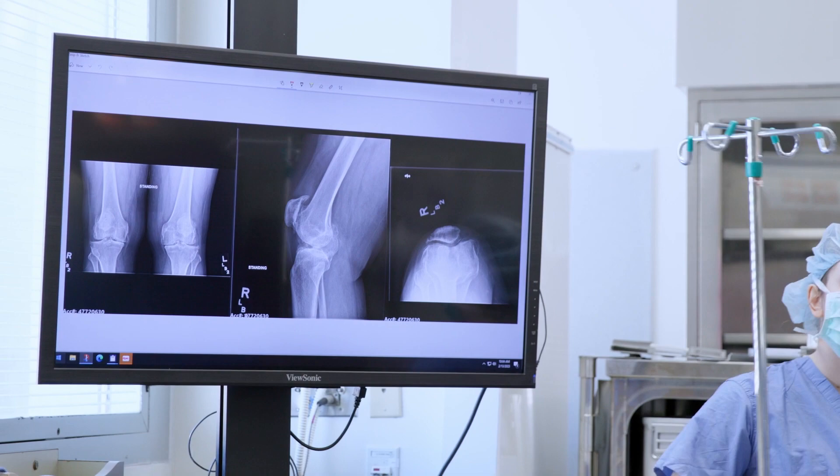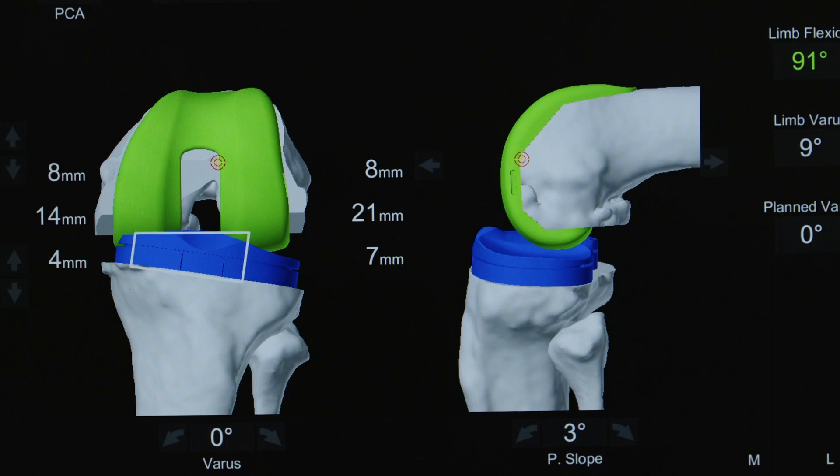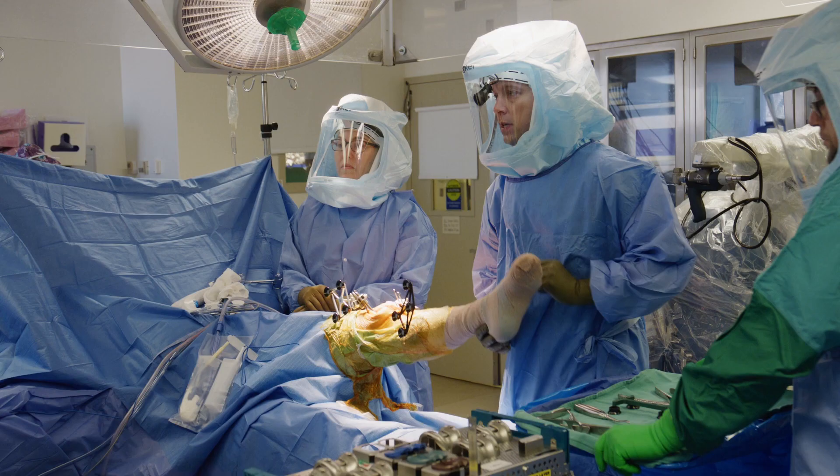The more traditional way of doing knee replacement is you take your measurements, do your best estimates and best alignment, and then after you've placed your implants, you start to do some little augmentations to the soft tissue around the knee. Robotics is different in the sense that you get a lot of information before you've made a single cut. You measure the tightness of the joint and start placing the components differently in space in a very precise way, so by the time you put the implants in, everything is pretty much balanced at that point.